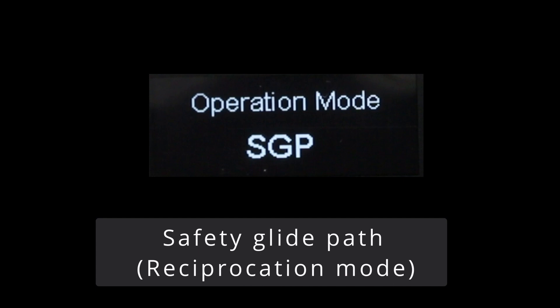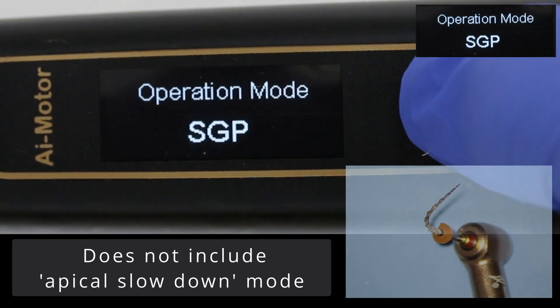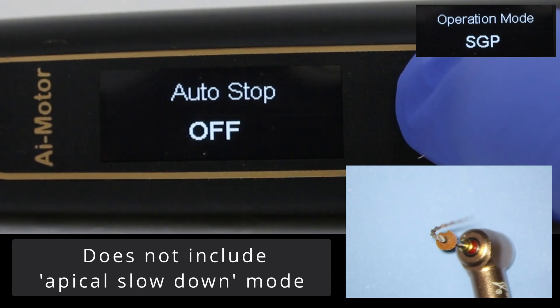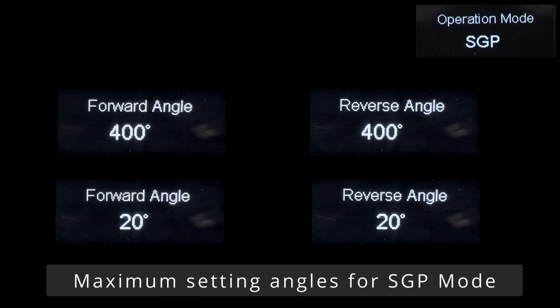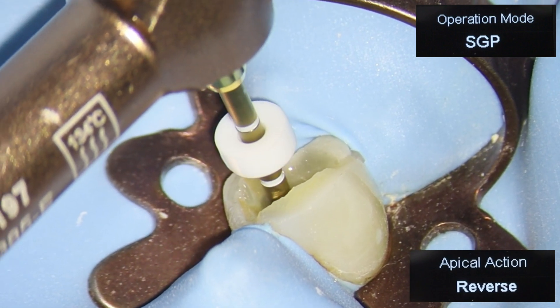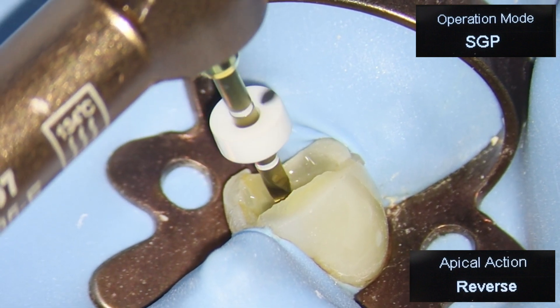The third mode is SGP, or safety glide path mode, which is essentially the mode you use if you want to use a file with reciprocation. This mode does not include apical slowdown. The USP of this handpiece is its customisable nature, and here it demonstrates the minimum and maximum angles that can be set for the forward and reverse rotation. SGP doesn't have apical slowdown, but it does work nicely with the reverse function.